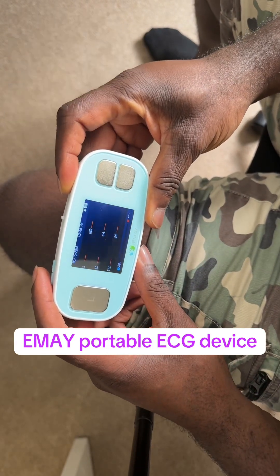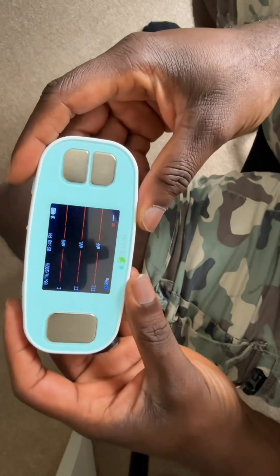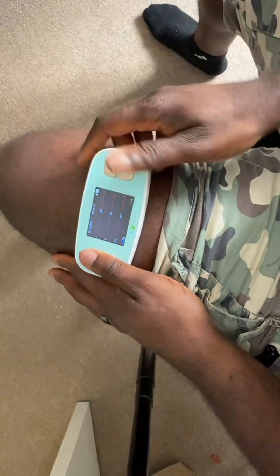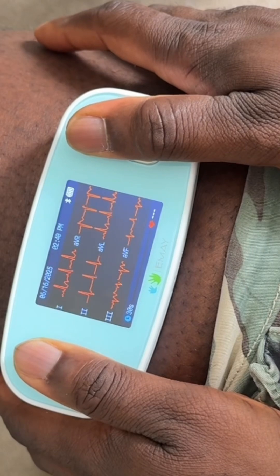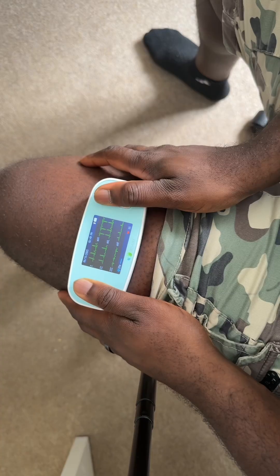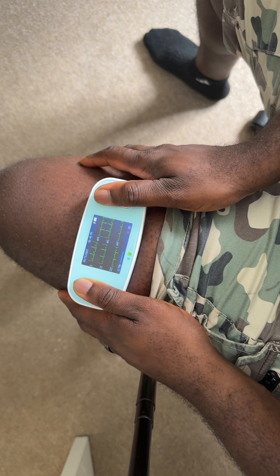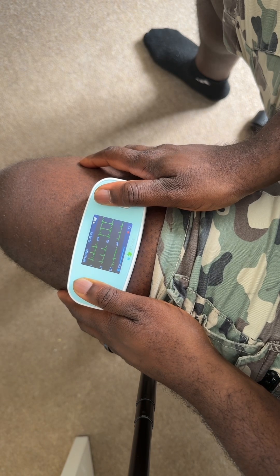Let me demonstrate how to use this device. This is the EMAY portable ECG device. If I place this on my thigh with my left thumb and my right thumb, it's checking my ECG. I'm seeing green, which means things are going well. It's going to count down from 30 seconds to zero and then give an analysis of my ECG.